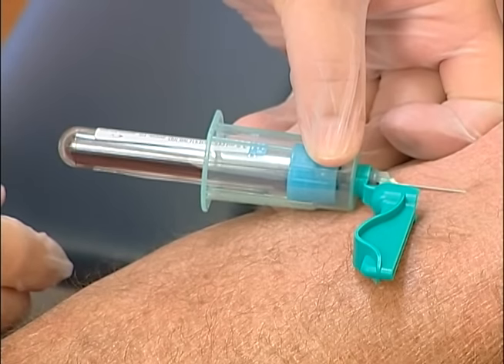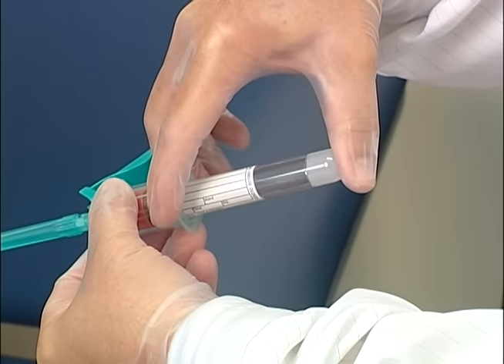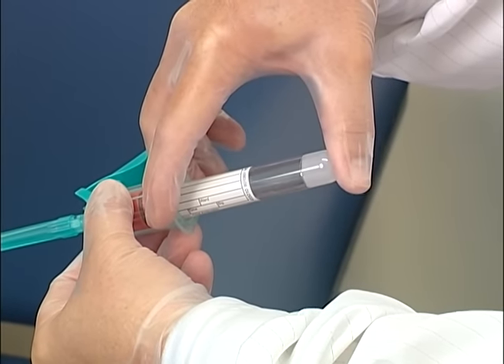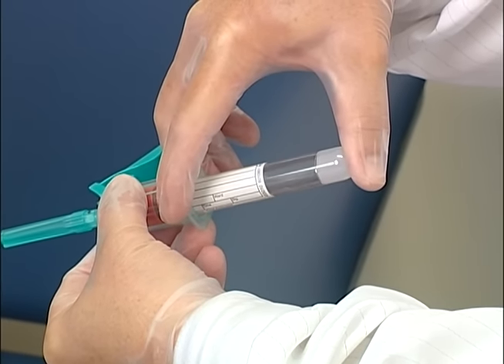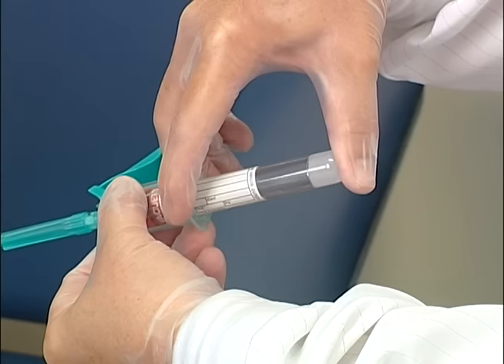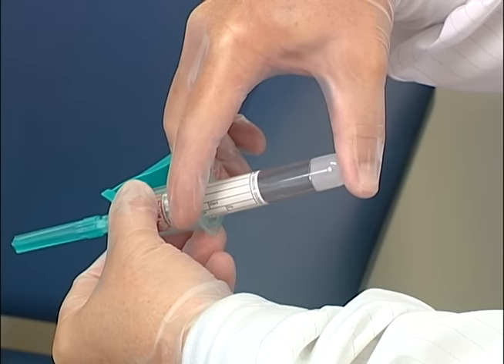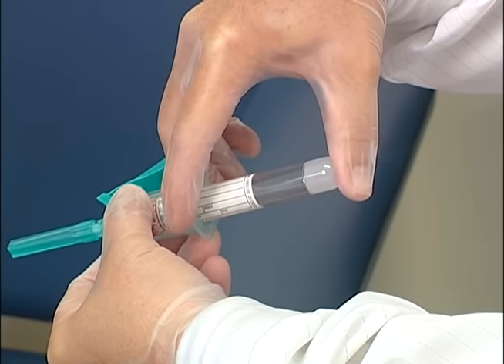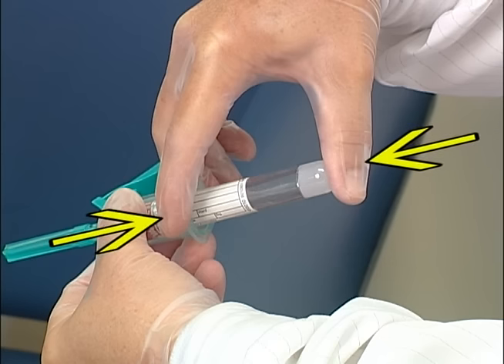Release the skin and advance the tube without displacing the needle. To maintain needle placement, apply the tube gently by placing one or two fingers on the flared wings of the tube holder and your thumb on the back of the tube. Squeeze your thumb and fingers together, advancing the tube so that its stopper is pierced by the interior needle. This counteracts the pushing pressure and keeps the needle from going through the other side of the vein and deeper into the arm.